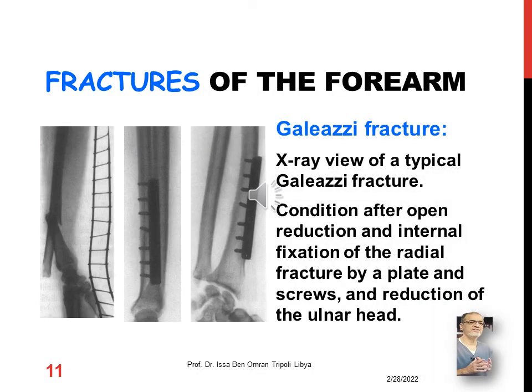We see here the open reduction and internal fixation of the Galeazzi fracture. The X-ray view of a typical Galeazzi fracture, condition after open reduction and internal fixation of the radial fracture by a plate and screws, and the reduction of the ulnar head.